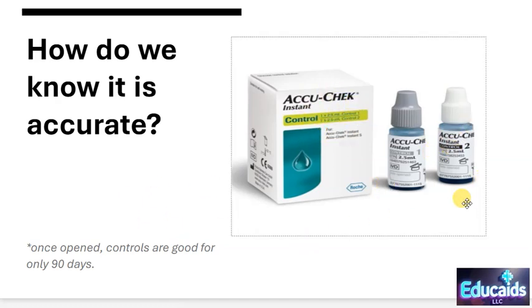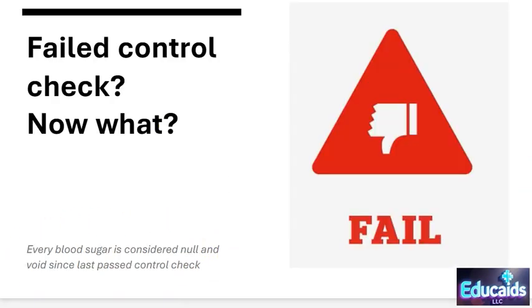Now if I do a control using the low control, or low pretend sugar, and I'm expecting a low reading, and it gives me a reading of 300, then I know my machine isn't reading accurately. So then we have to call Biomed. Once these bottles are open, they're only good for 90 days, and then obviously we can't use them if they're expired.